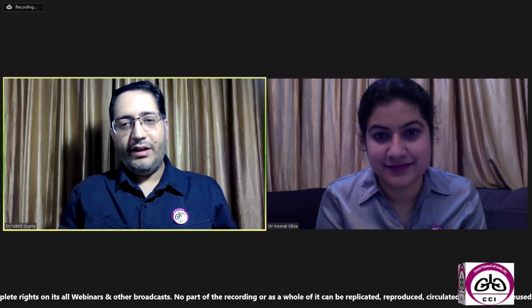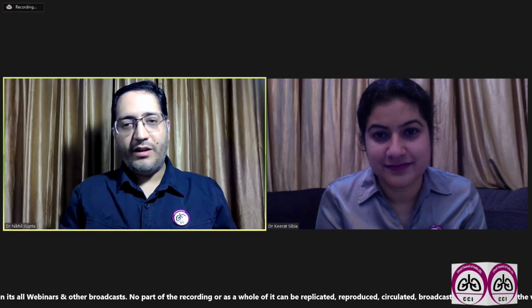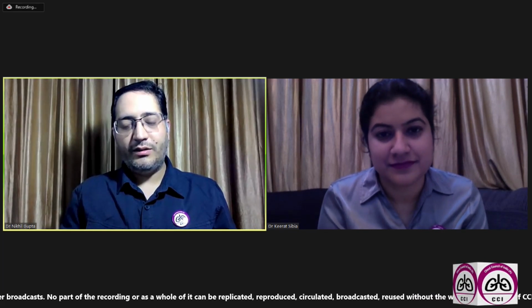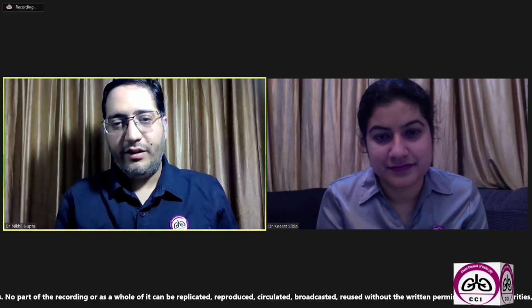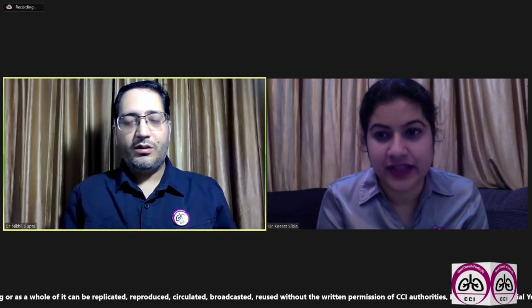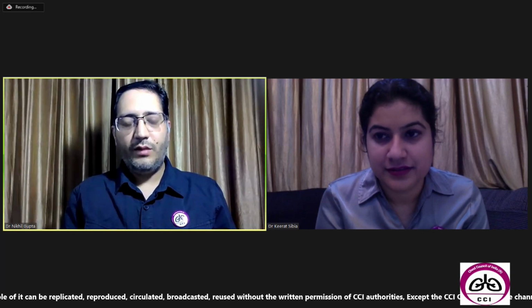And in ILD, there is generally reticular opacities more towards the bases, because ILD is seen with the apicobasal gradient. So there would be different kinds of UIP pneumonia. UIP is the most common type. Maybe fibrosis in the basal areas or in the upper areas, in the apical areas, depending on the type of ILD again.